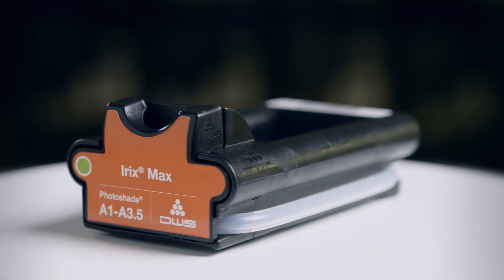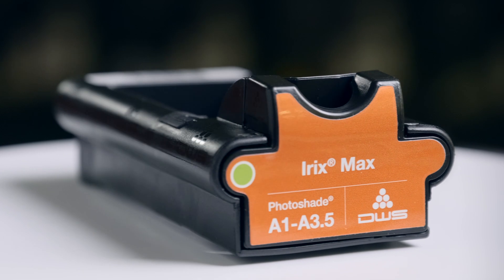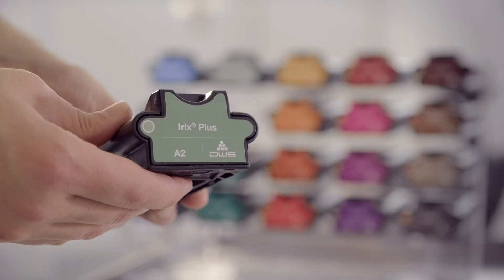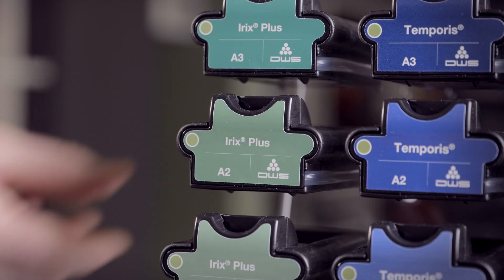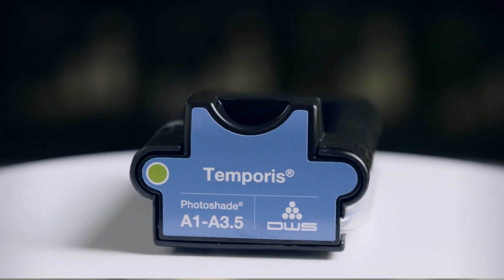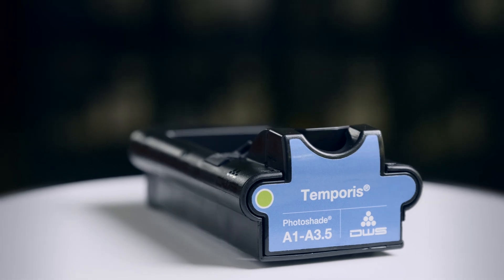Irix Max is the top of the line hybrid ceramic for permanent restorations that offers ultimate performance and aesthetics. Irix Plus is the ultimate hybrid composite that combines high performance and cost efficiency in permanent restorations. Temporis is the ideal composite material for long-term temporary restorations.